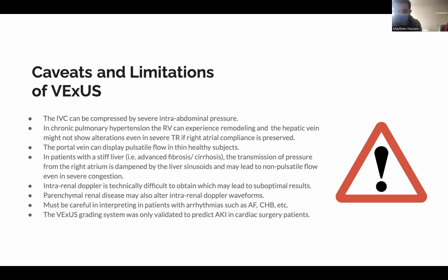And those need to be interpreted with caution, ideally having an ECG on board at the same time to help you make distinctions of when systole is occurring and when diastole is occurring. So again, as in anything with medicine, it has its caveats, and you need to recognize the limitations of doing such a study. And like we said before, it shouldn't be done on its own, and decisions shouldn't be solely based on this, but with the whole clinical picture in mind altogether.